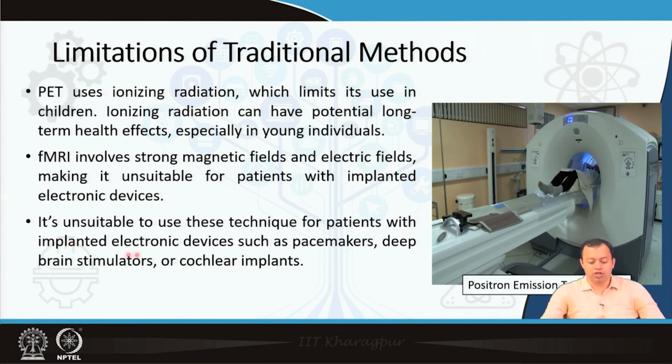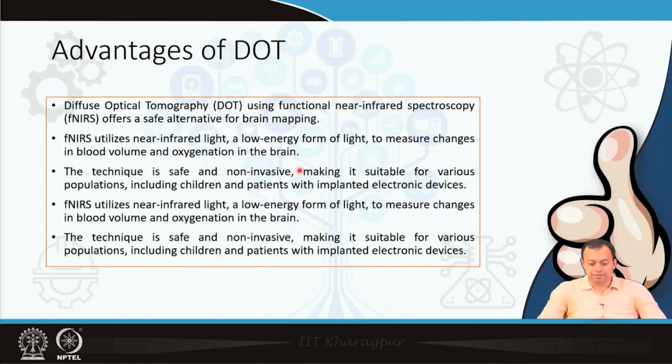It is unsuitable to use this technique for patients with implanted electronic devices such as pacemakers, deep brain stimulators or cochlear implants. Even if you have a hearing aid, some hearing aid implants are actually inside, which help if you have internal damage, then you obviously cannot use strong magnetic and electric fields, right.